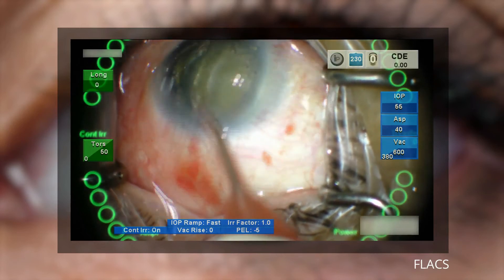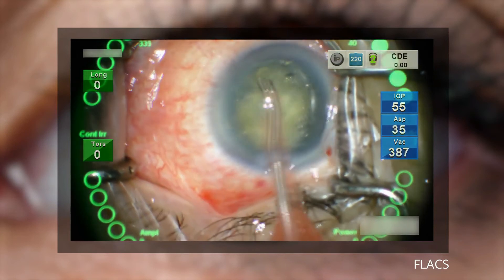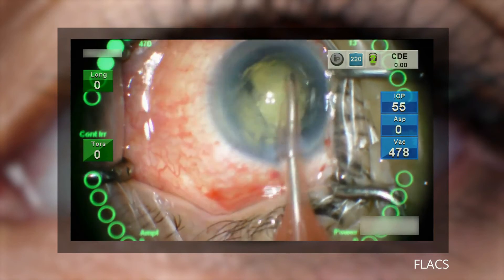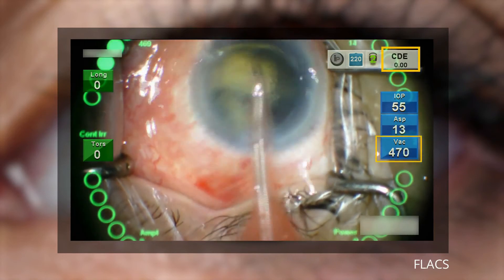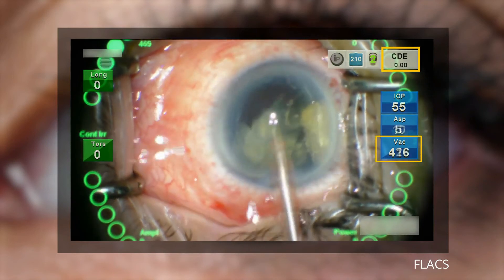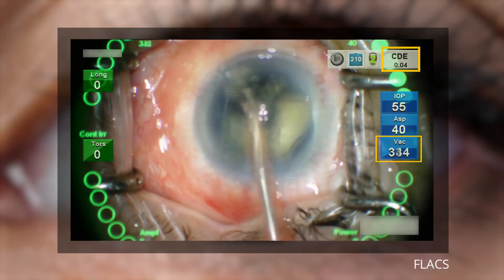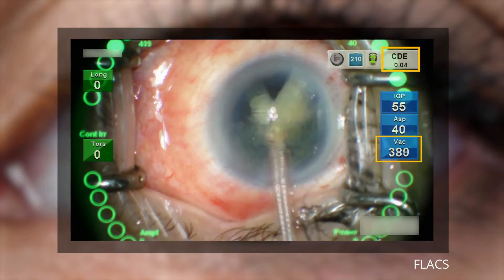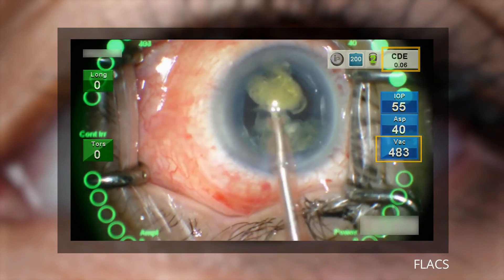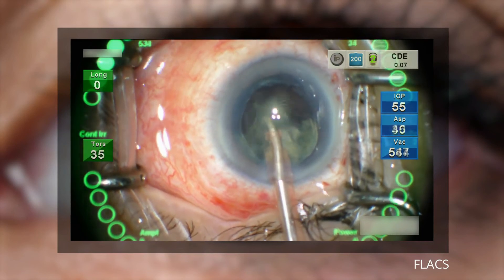Phacoemulsification is performed in a similar way as the conventional procedure, using the same phaco tip placement techniques, with the tip placed beveled down in the central anterior chamber to aspirate and remove the nucleus material. Linear control of torsional power with a delineated foot pedal movement control makes it possible to minimize the energy used for cataract removal. Note the lower CDE with the FLACS procedure compared with what was seen with the conventional surgery. Torsional ultrasound energy is less with the FLACS procedure due to fragmentation of the lens, which is mostly aspirated with high vacuum. Torsional phaco allows for improved nuclear followability, which can result in shorter cumulative tip travel and shorter procedure time.